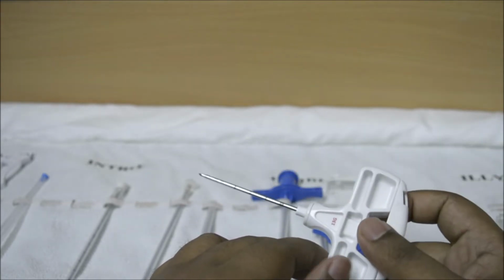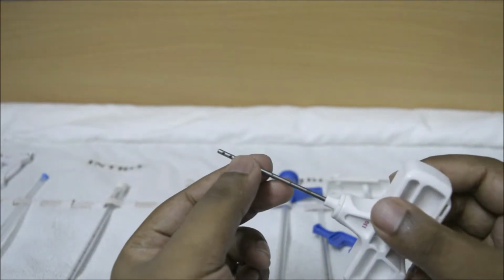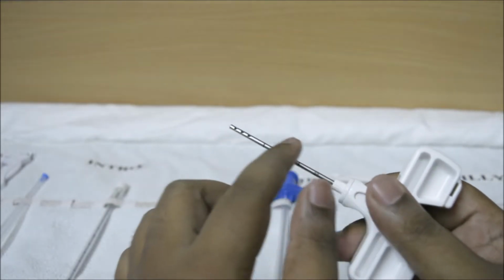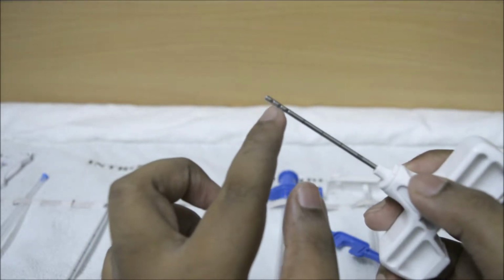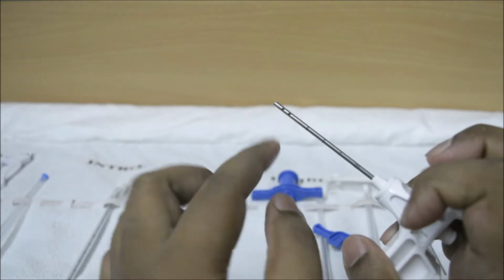So how is it performed? As you can see, the needle cannula has distinct pores, or holes, inside. This particular variant has 5 holes. Focus on the tip: 1, 2, 3, and then on the other side 2 holes.